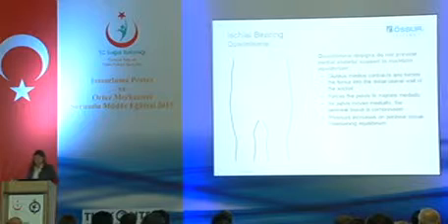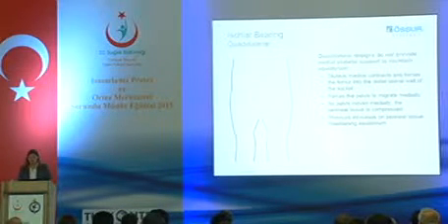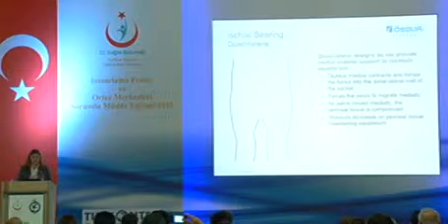However, the quadrilateral designs do not provide medial skeletal support to maintain equilibrium.